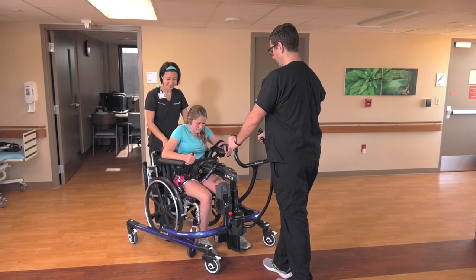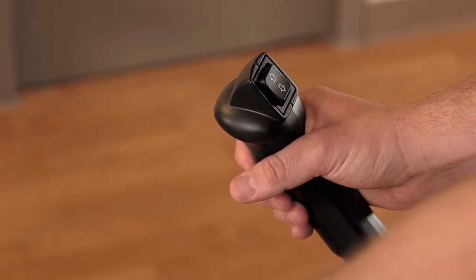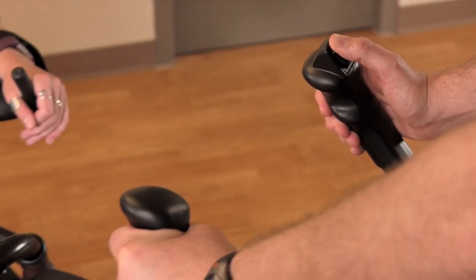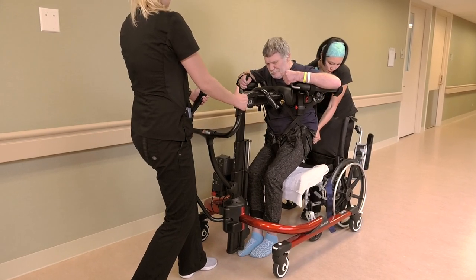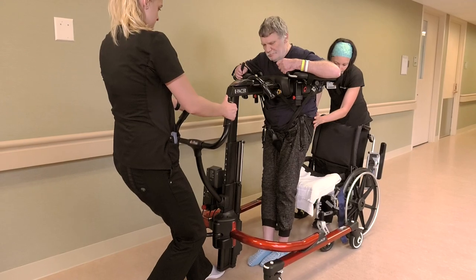When both the body support system and pelvic support are secure, the patient is ready to be lifted. Grasp the handles on the front of the E-pacer and use the switch on the right handlebar to operate the lift. Take two to three steps backwards as you lift, pulling the patient forward, nose over knees.